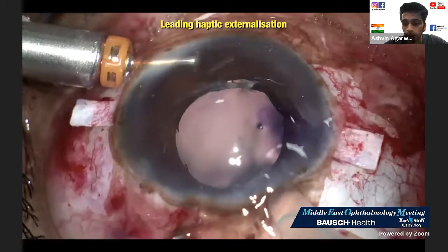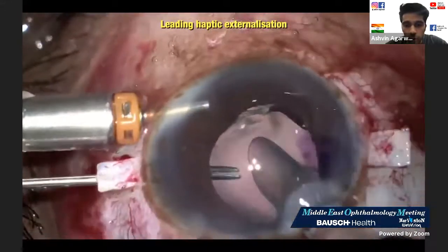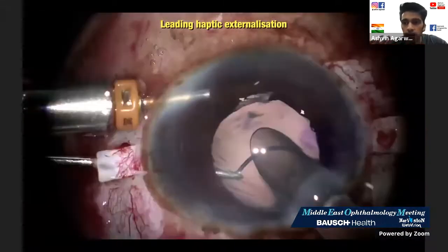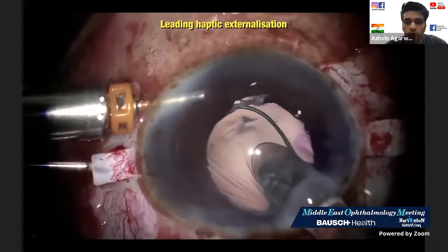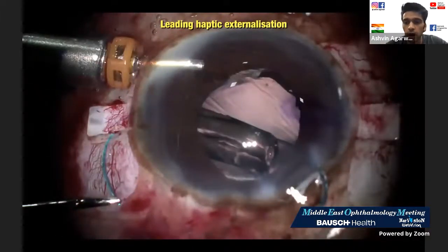So now, once I have inserted the injector in, I have my glued intraocular lens forceps. Now all I need to do is eject a little bit of that intraocular lens and I can grab it. Now I'm safe. Once I'm safe, I can now inject the whole optic. And while I'm injecting the optic, or even if not, I can externalize one haptic. This is the first haptic out. The second haptic is now lying outside the eye through the main incision, if you see here very clearly.